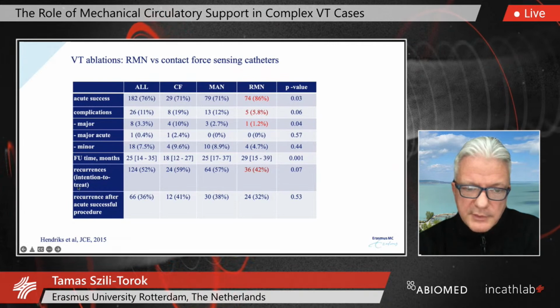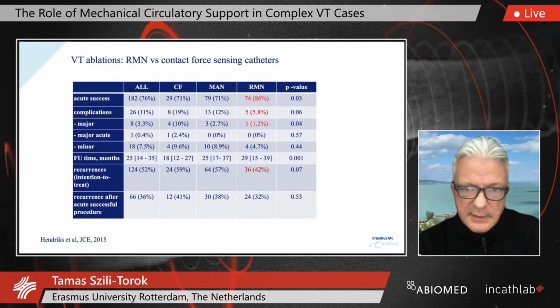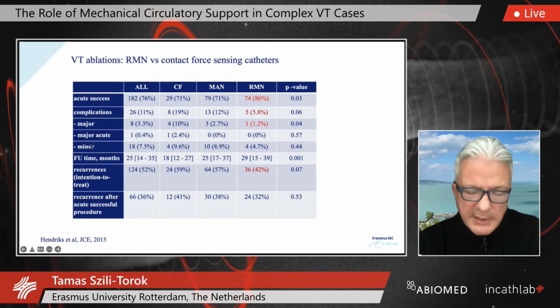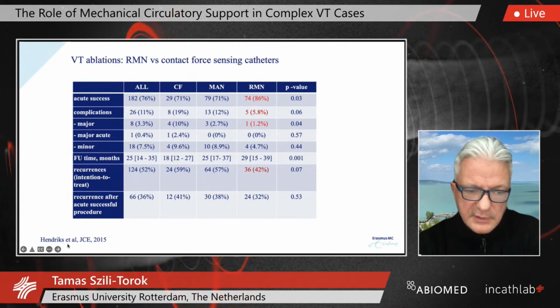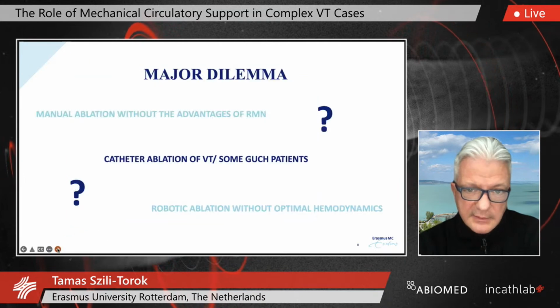We all know that the contact force catheters came into the picture later, in the last 10 years, and we reanalyzed our data. Interestingly enough, the remote magnetic navigation remained superior, and using contact force in VT ablation didn't add anything to the previously used manual catheters.